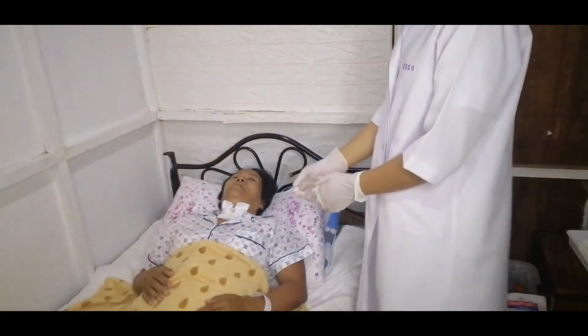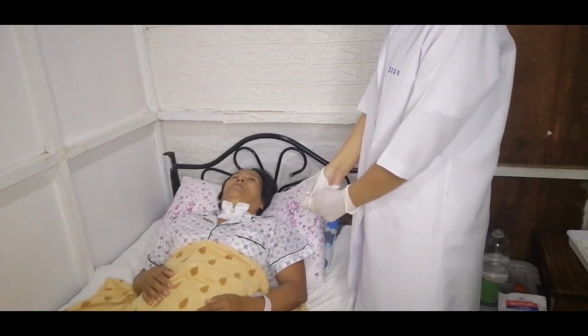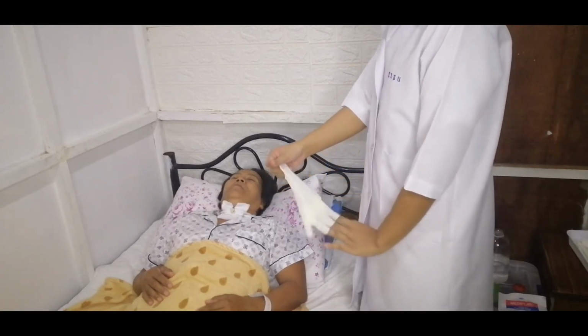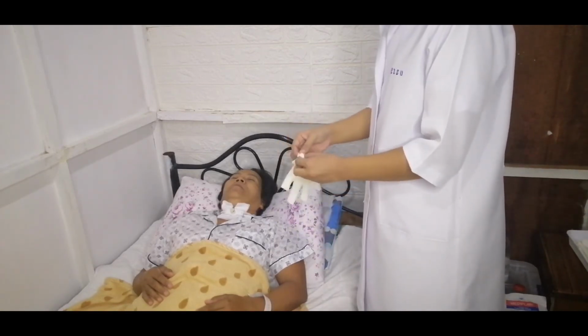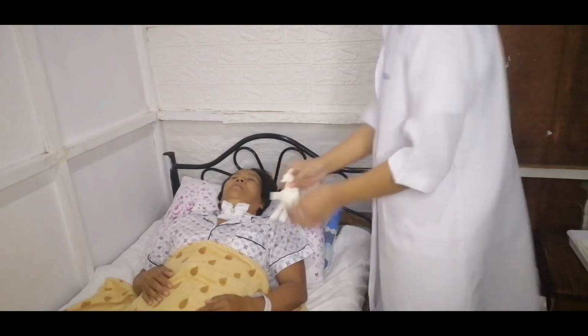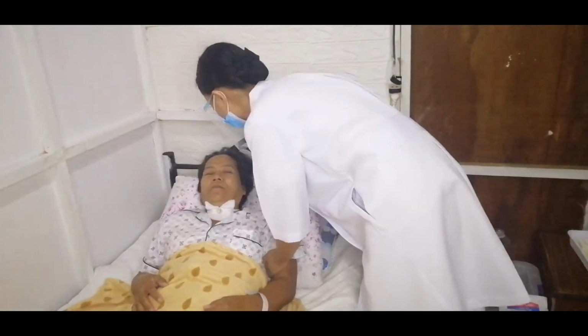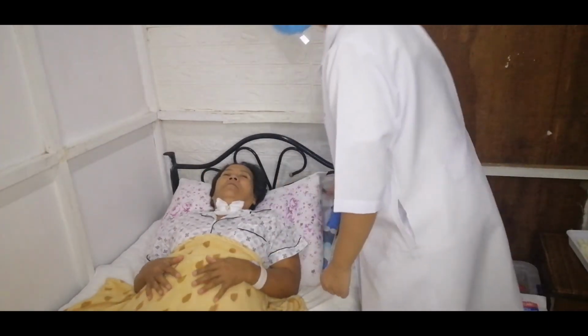Remove gloves, then assist the patient to a comfortable position. Raise the bed rail and place the bed to the lowest position. Remove additional PPE if used. Perform hand hygiene, then documentation.